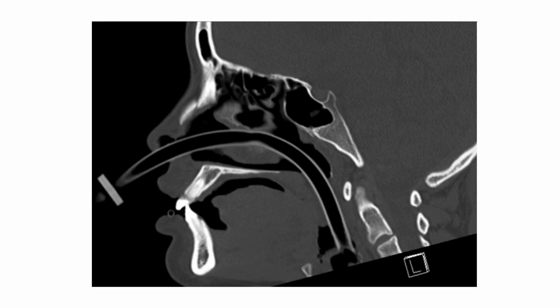This is actually a patient I took care of in the pediatric ER who had one placed prior to my assessment, and she made it over to the CAT scanner, and you can see here that it's much too long. Here's the edge of her nose, and you can see the edge of the NPA, but if you follow the NPA all around you can see it's pushing her tongue out of the way. It's going directly towards the trachea, just like you want it to do, to help open a passageway for air to come through.